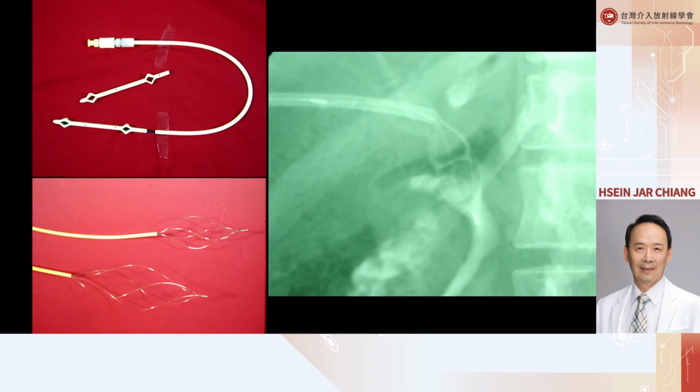And then, at that time, we performed some double mushroom biliary stent insertion. There is a pusher. I found this pusher is very good for use as a working tract, and the basket can be inserted through the pusher into the bile duct to catch the stone. Then hold the pusher still and just pull back the basket. The stone will be very easily broken. So I started to use this way to do a lot of bile duct stone and gallbladder stone removal.